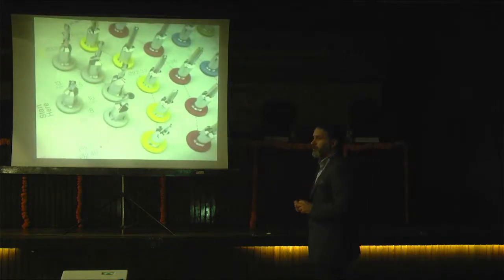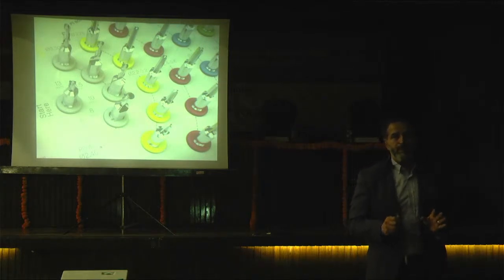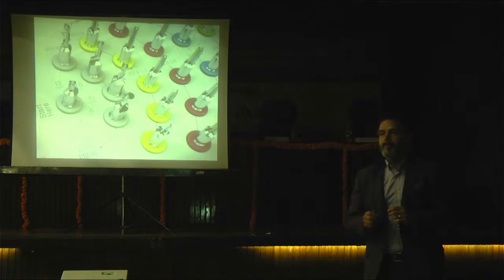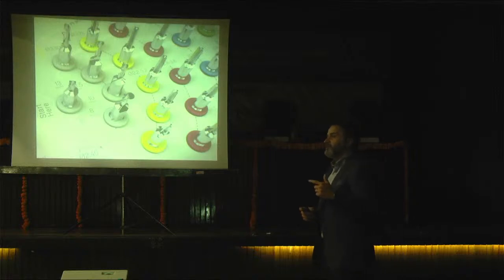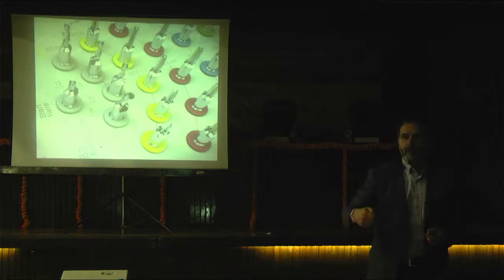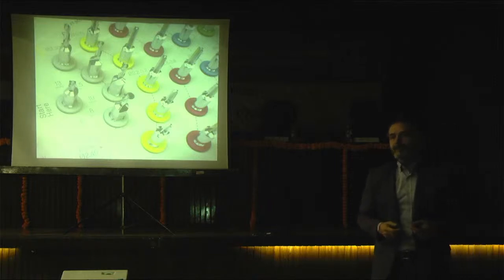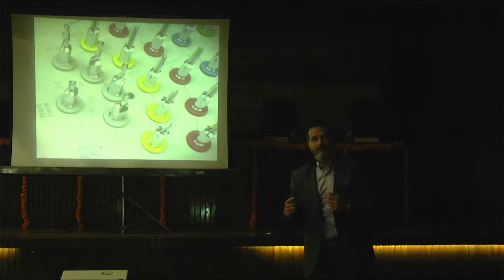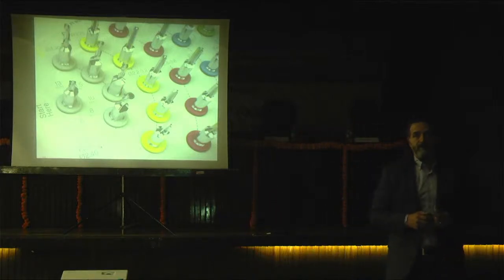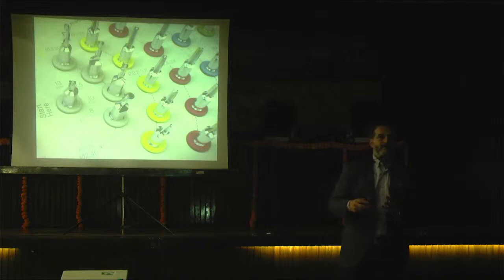So we have a special kit, a special set for placing implants. Normally, when you place an implant, the brand brings you a set, a kit. And when you want to do any guided surgery, they give only one, two, three apparatus and instruments. It's just like a complementary apparatus for adapting one drill to another drill, so it is not easy to use. But for M-Guided surgery, you have a special kit beside the normal kit.